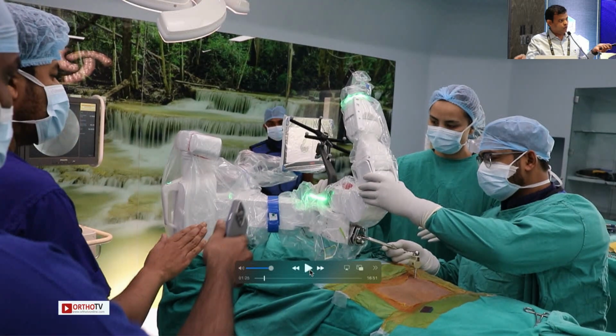So, Dr. Bauk, how do you ensure that the relationship between the robot and the patient stays accurate? So I rely on the intraoperative CT scan. If I have to just do a minimally invasive TLIF, then we can get away with the pre-op CT scan. The Globus one is different from this. The Globus one also works with simple X-rays, so we may not need CT for Globus. We can just take a fluoroscopic shot, and there is a tracker on the C-arm itself, because it's like a 2D navigation, and then the robot can work on that.